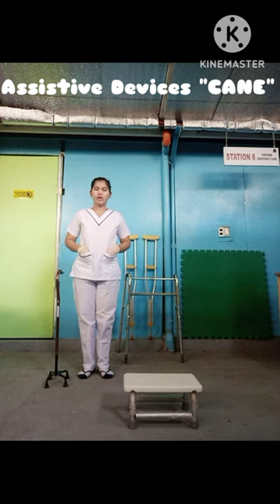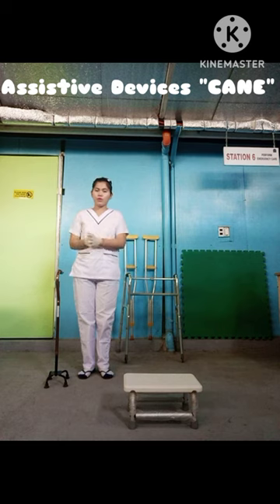Hi, Assessor. My name is Ruth Kim. Today I will demonstrate how to use the cane. But before that, I'm going to wash my hands, sanitize, then put the gloves on.